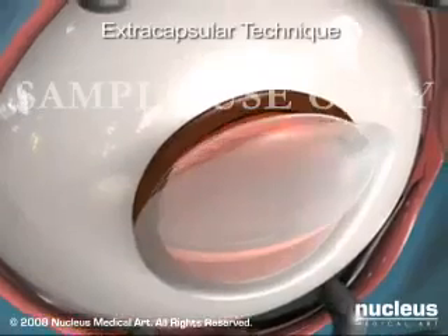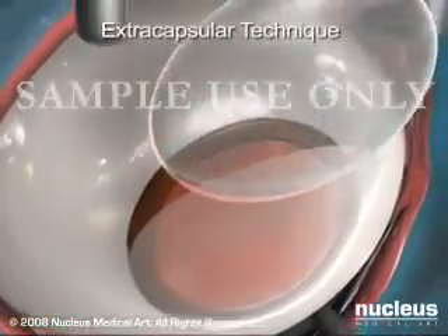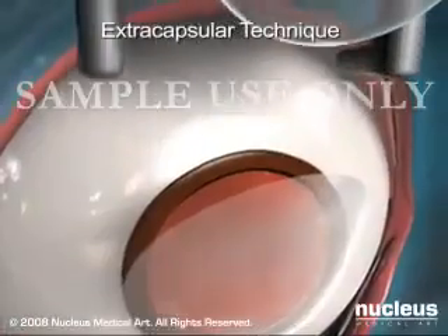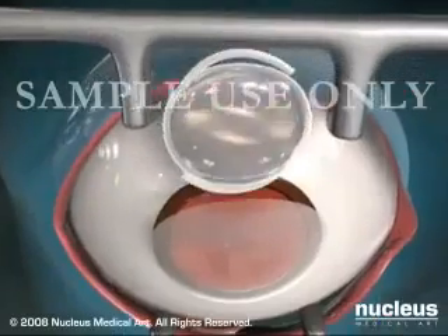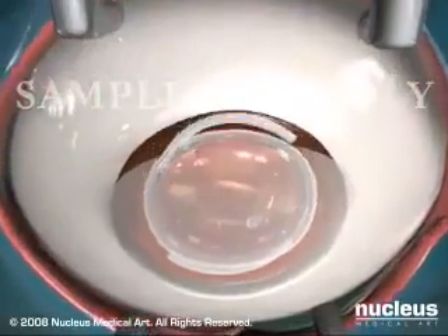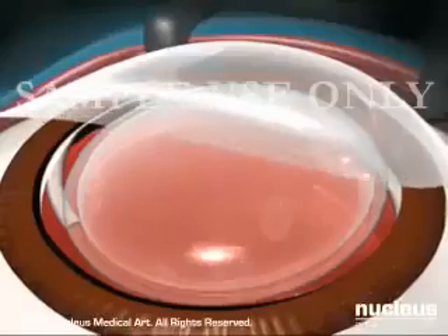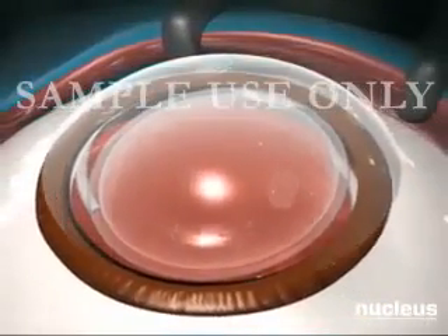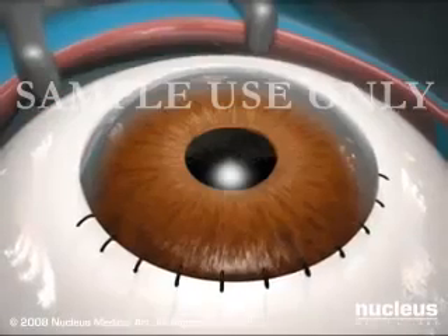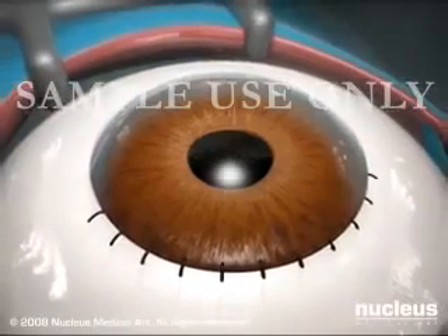In this procedure, the incision made near the cornea is large enough to remove the cataract in one piece. Again, an artificial lens is inserted to replace the natural lens. Recovery from this type of cataract surgery is usually slower. Because the incision is larger, this procedure does require stitches.